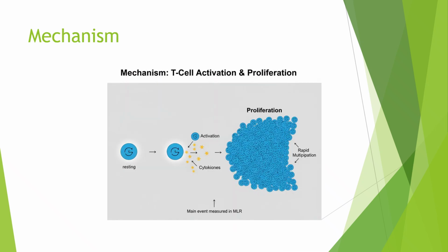Because of this recognition, the T cells wake up from a resting state. They become active, release cytokines, and multiply very fast. This rapid growth, or proliferation, is the main event we measure in this test.